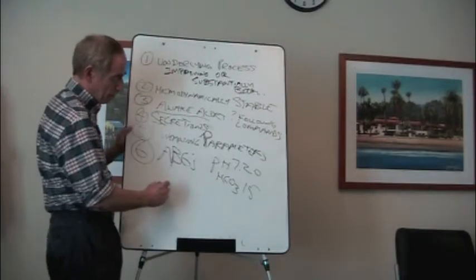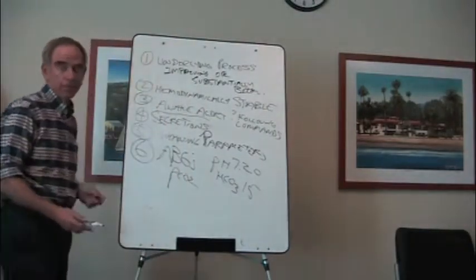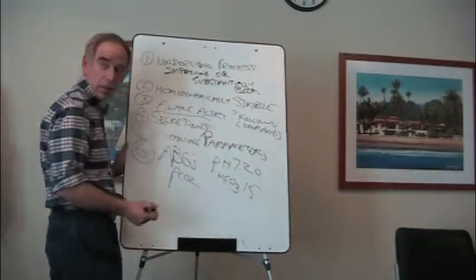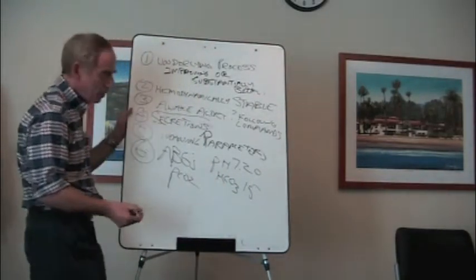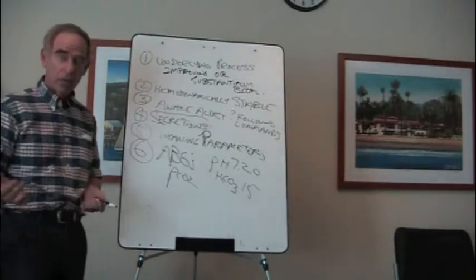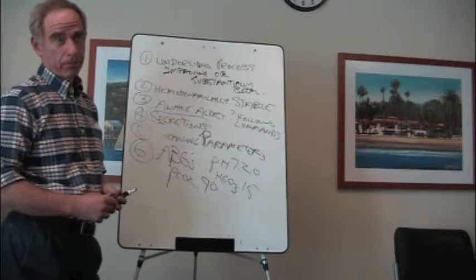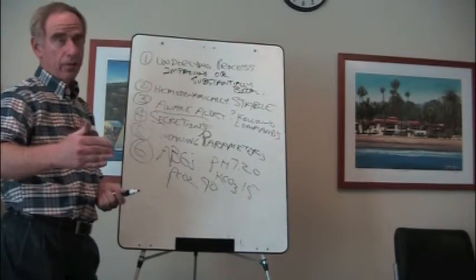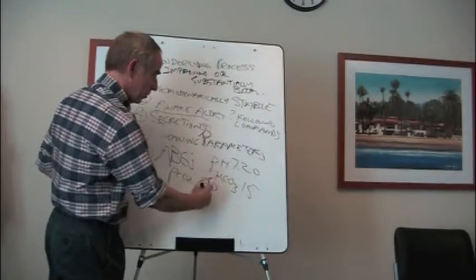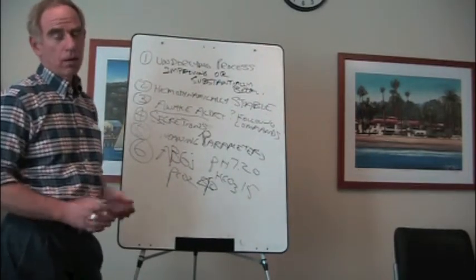Okay, so what about the PCO2 on the blood gas? What do you want the PCO2 to be? Near their baseline? Near their baseline, good. So, not 40? Maybe. It depends on the baseline. Okay, so it depends on the baseline. If their PCO2 is normally 55, you don't want to get their PCO2 down to 40. Why? So their normal PCO2 is 55. I'm ventilating the patient for 2-3 days, and over a period of time, I have lowered their PCO2 to 40, which is a normal PCO2. So why is that not good?